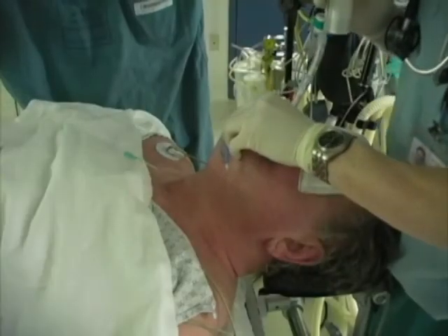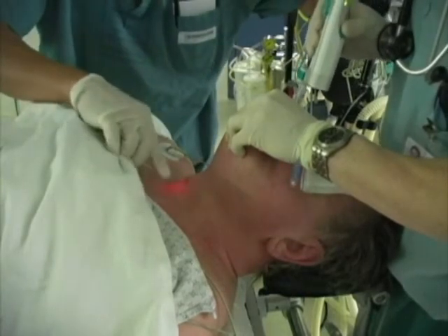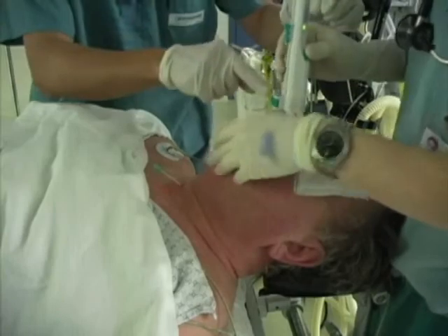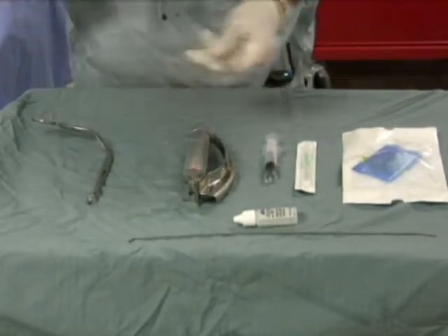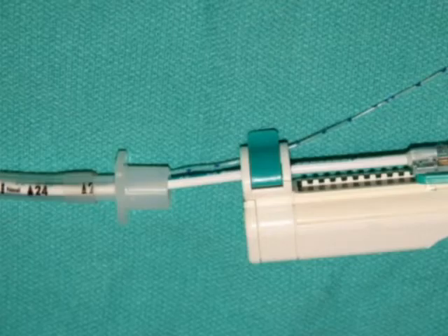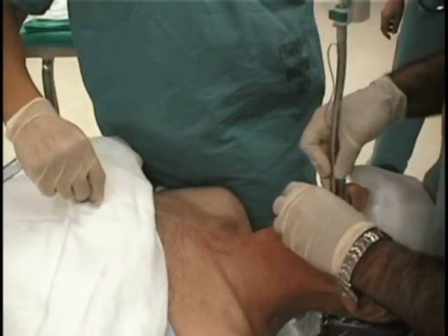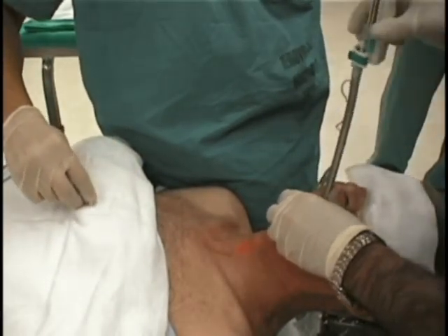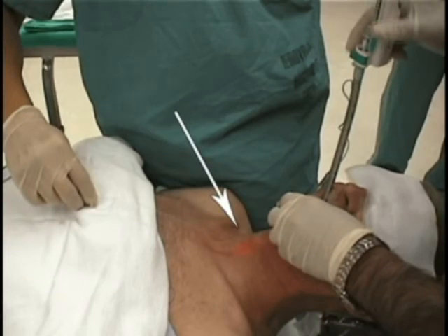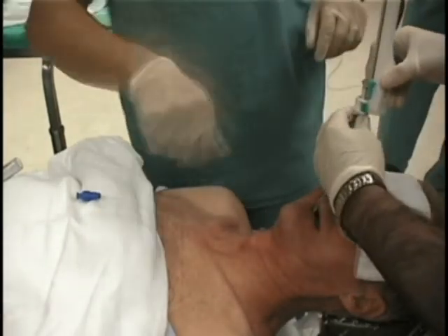Transillumination using the Trachlite: the placement of the light bulb of a light wand at the tip of the tracheal tube during retrograde intubation can potentially guide tube advancement, as a bright circumscribed glow can readily be seen in the anterior neck when the tip of the tracheal tube enters the glottic opening. With the internal rigid stylet removed, the pliable Trachlite is inserted into the tracheal tube alongside the guide wire or epidural catheter until the light bulb is positioned close to the tip of the tracheal tube, as shown in this video. While maintaining the midline position, the assembly negotiates its way to the glottic opening. When the tip of the tracheal tube enters the glottic opening, a bright circumscribed glow can be seen readily below the thyroid prominence. While relaxing the tension of the epidural catheter at the distal end, the tracheal tube and Trachlite assembly can be advanced further into the trachea. The Trachlite is then removed.